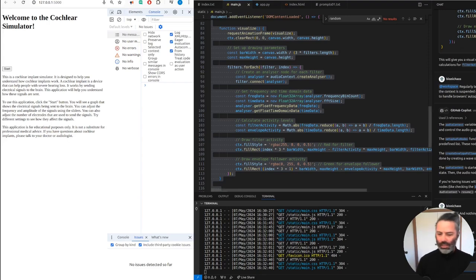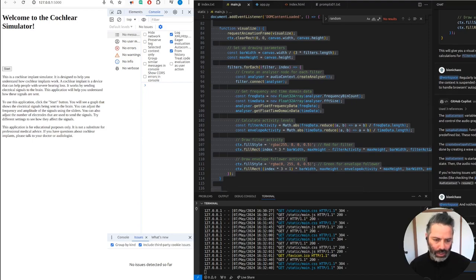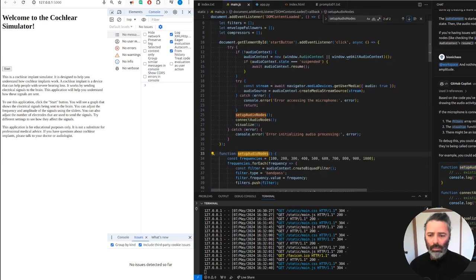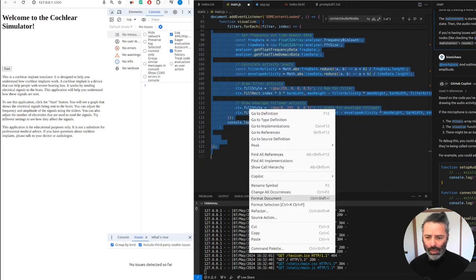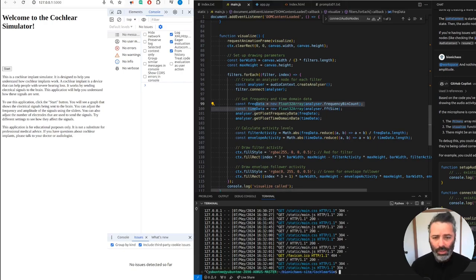Yeah, we're asking for too much to begin with, and then we're trying to fix the little things. Yeah, we need more debugging, to see if everything is being called correctly. Some sort of initialization problem, is it?